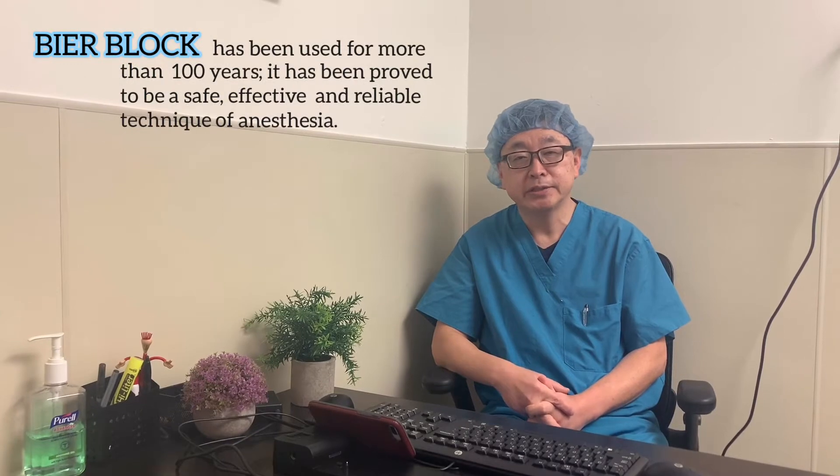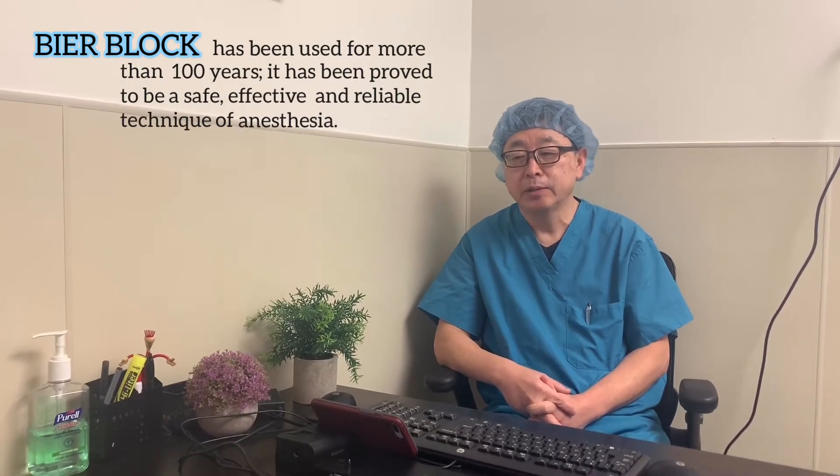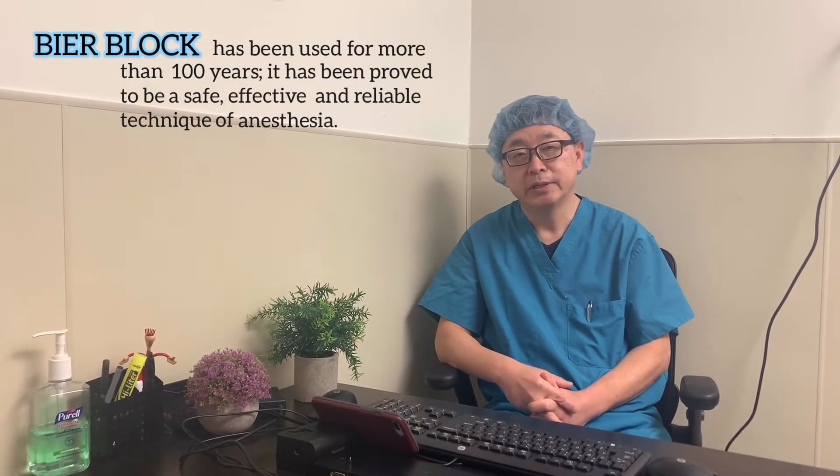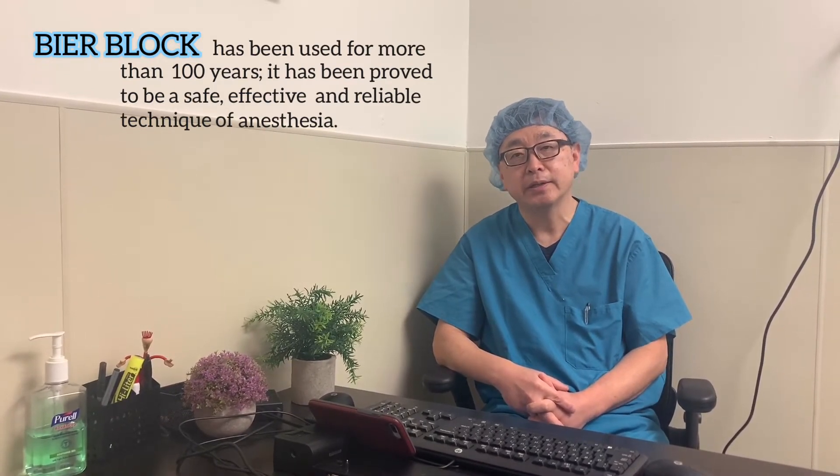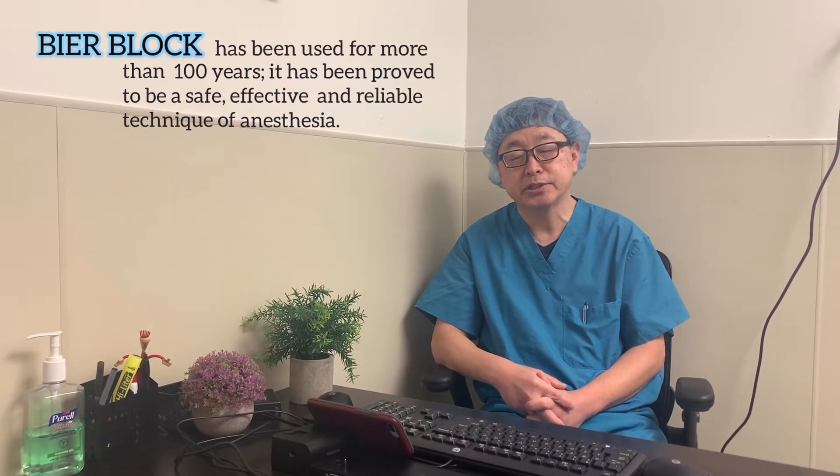Bier block is a regional anesthesia which has been used for more than a hundred years. It is widely used in the emergency department and perioperative surgical settings. Our surgeons at the San Francisco Surgery Center still request Bier block for surgical procedures of the upper extremity below the elbow. It is a very good anesthesia technique for short procedures, like a carpal tunnel release.